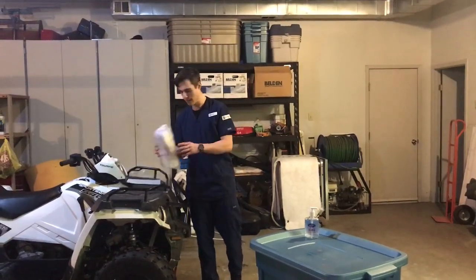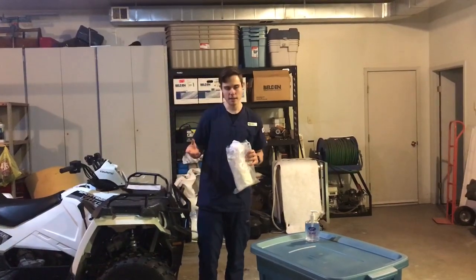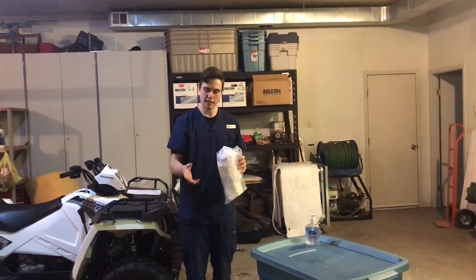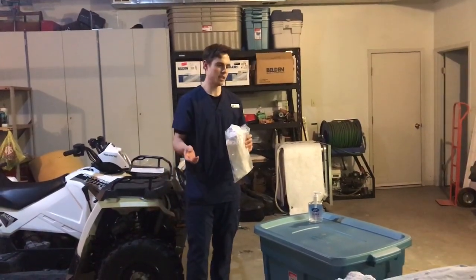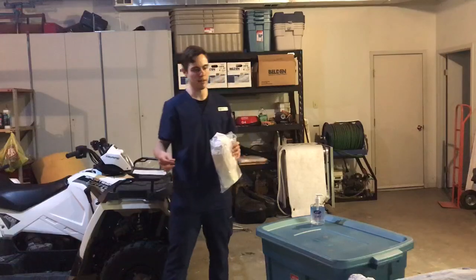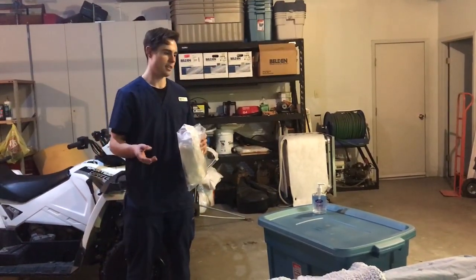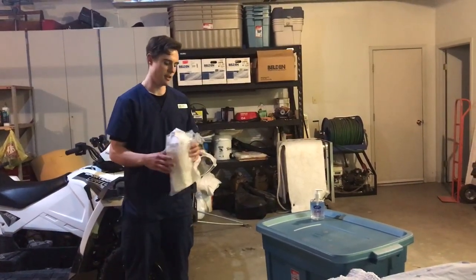Once I have my supplies, I'm going to go over to the patient's room. Upon entering, I'm going to do an entry safety check and everything that entails, which is the bed in the lowest position, call bell within reach, patient in no distress, and then I will introduce myself with my name and designation. I am Alex Lesiuk, student nurse at the University of Manitoba, and I'm going to be inserting your catheter today.